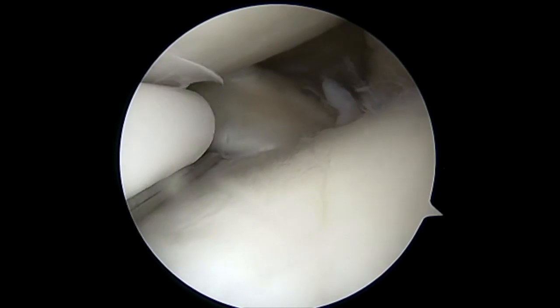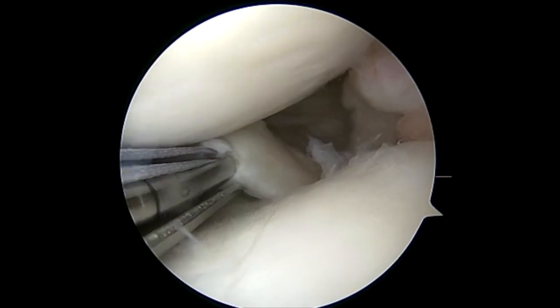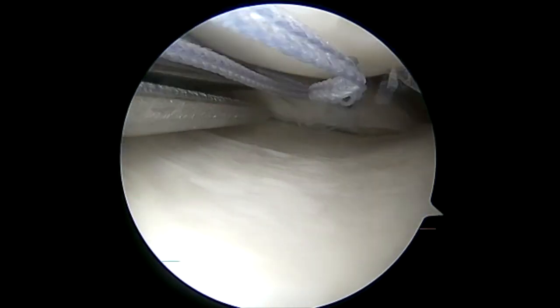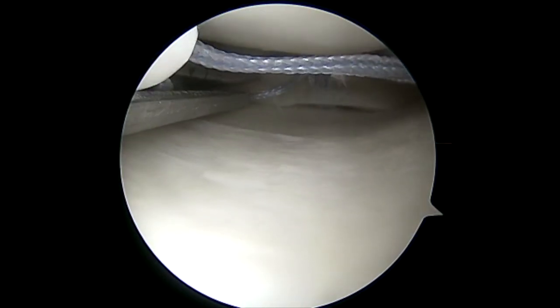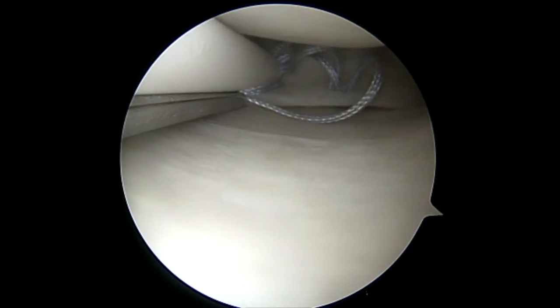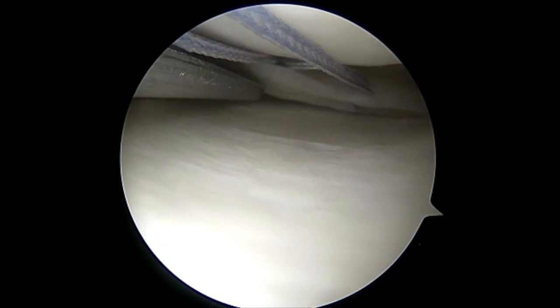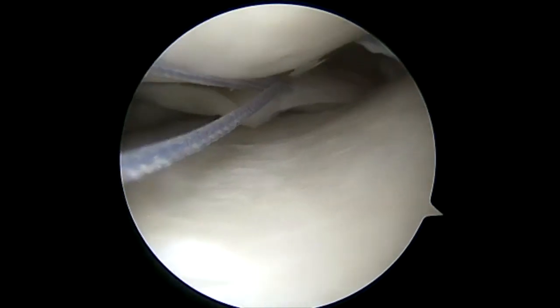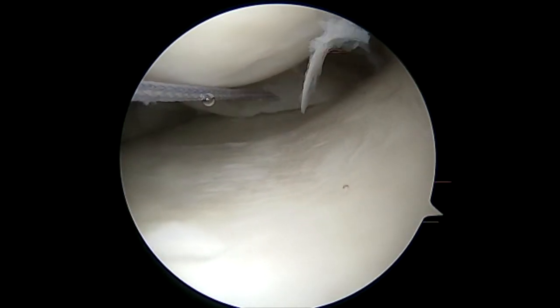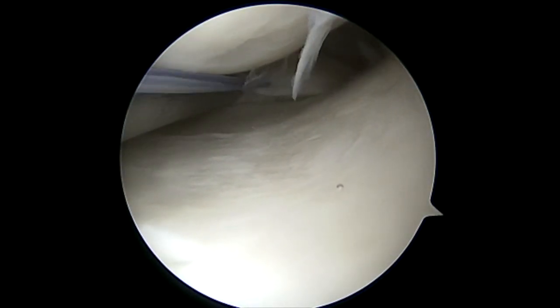Once the first portion is placed, we slowly reduce the needle and place it a second time, again in a combination of a horizontal and vertical mattress configuration. Once this is removed, we tension the loop outside of the knee and use the metal cannula and a knot pusher to further tension the meniscus back to the capsule, as you can see here.